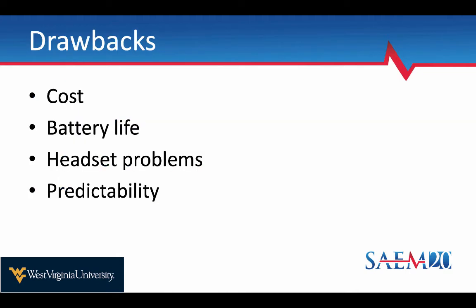As always, there are drawbacks to everything, cost being one of the main ones. Dr. Minardi already pointed out that battery life was one of the main topics our students kept talking about. The glasses have a limited amount of time that you can learn with them, and let's face it, it's tough to convince people to plug things back in after they're done using them, and that always has problems. The other part is we're at a large medical school, a health sciences center, with a large simulation center that has the resources to purchase this stuff. The Biomedics platform is not cheap. You're probably not going to buy this for a group of 10 residents.